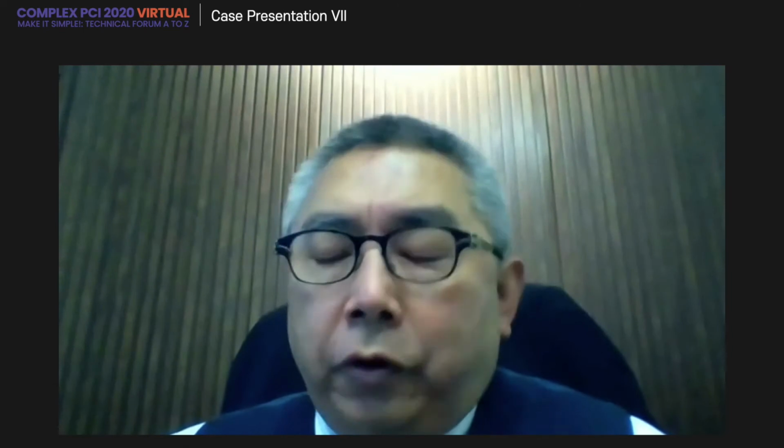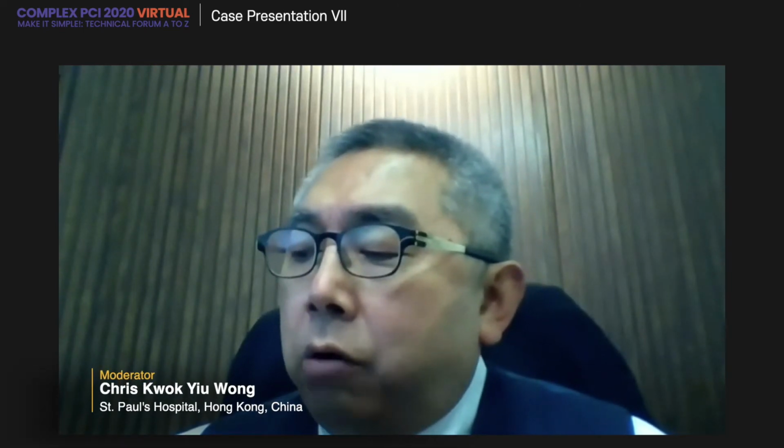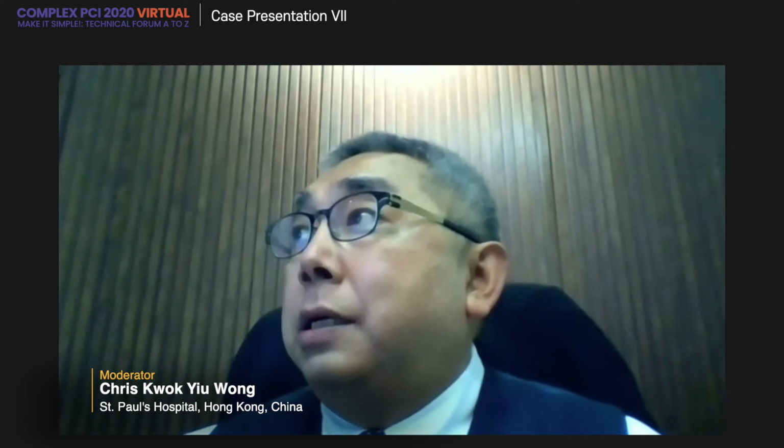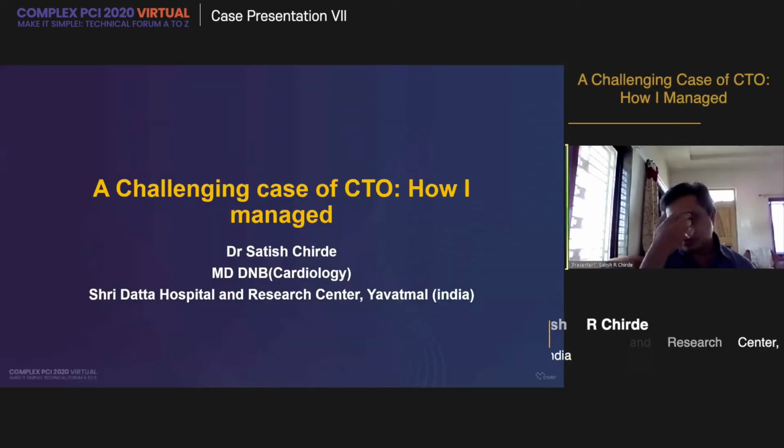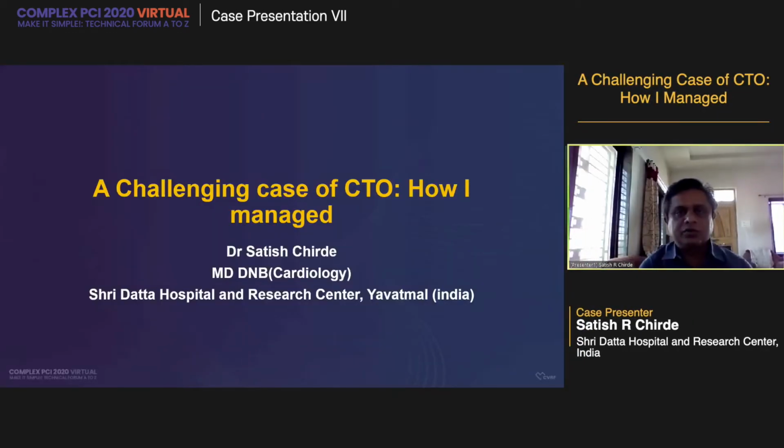The first case is a challenging case of CTO, and how I managed it, by Dr. Satish Chirde from India. Dr. Chirde, please. Yeah, this is the case of chronic total occlusion.